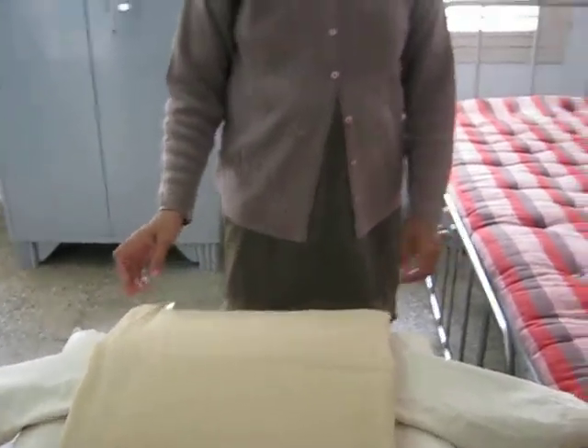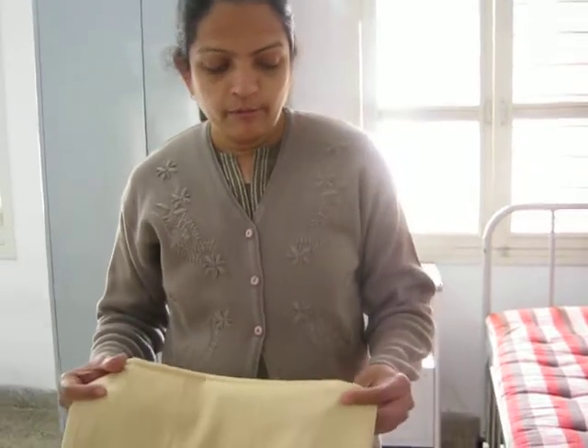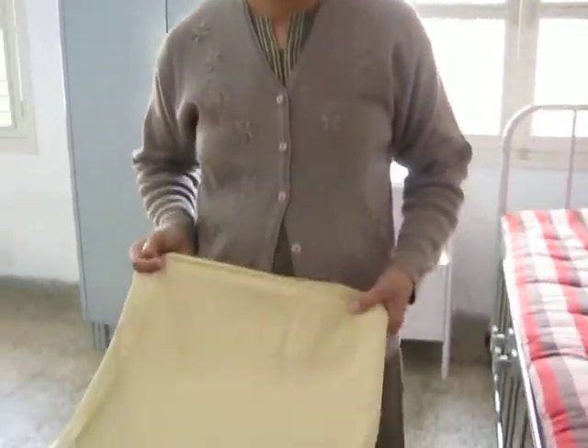I am going to show you the open bed. An open bed is prepared for the patient who is ambulant. For that we require two bed sheets, one mackintosh, draw sheet, pillow and pillow cover. Basic things like the bed and mattress are already available in the hospital.